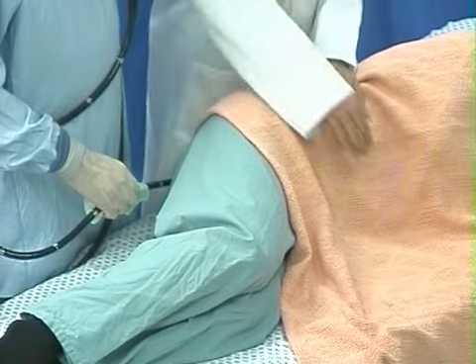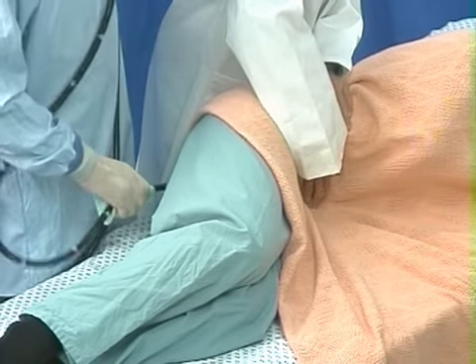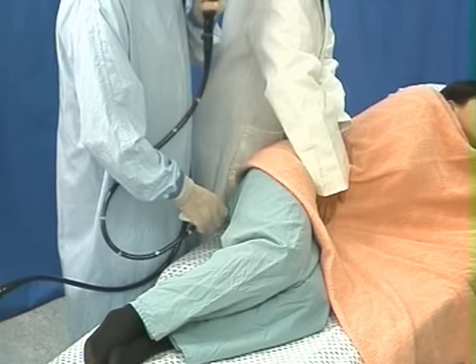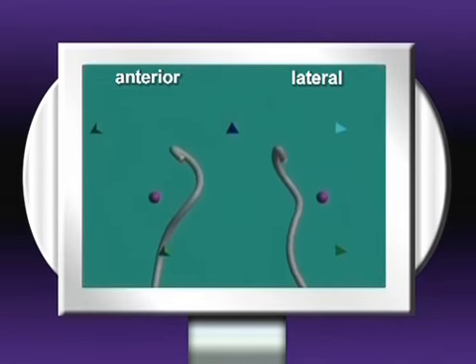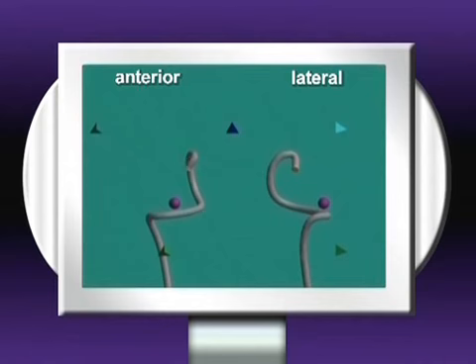Studies have shown that without using Scopeguide, sigmoid hand pressure is ineffective 2/3 of the time, either because the loop is inaccessible or because pressure is in the wrong place. Here, pressing exactly over a transverse loop helped make the scope slide in proximally. Here, attempted sigmoid loop pressure was ineffectual.